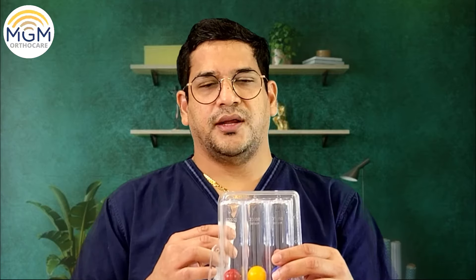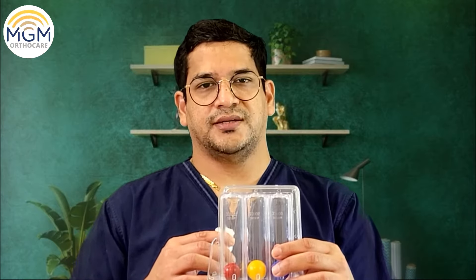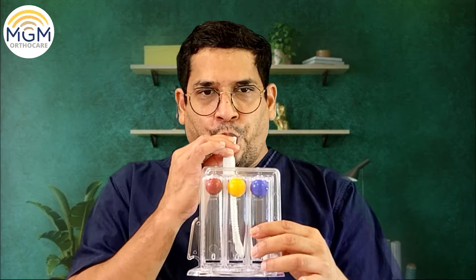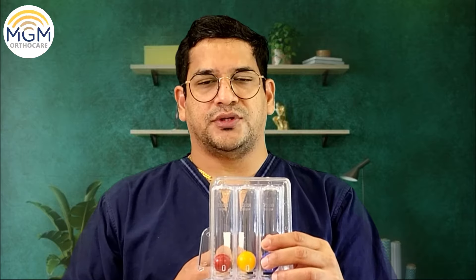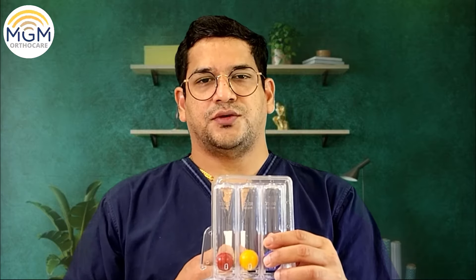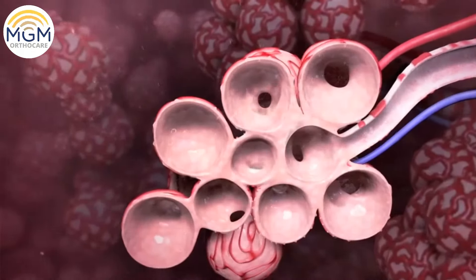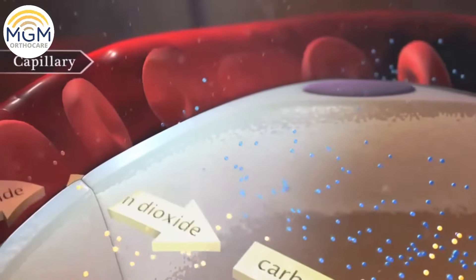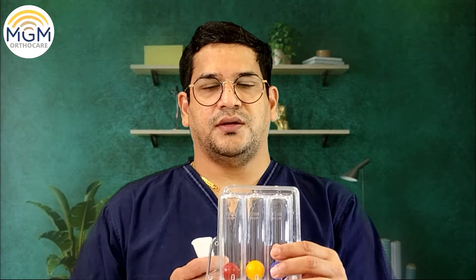Just hold it in your mouth and take a slow deep breath. See how these three balls are going up, and hold it there for two to three seconds. Holding this for two to three seconds will open up our alveoli, which is a small air sac where the maximum exchange of oxygen and carbon dioxide takes place. When you do this, it will increase our saturation capacity.